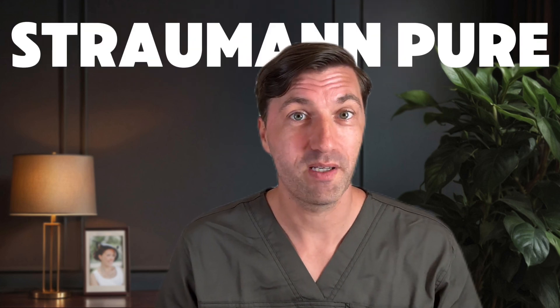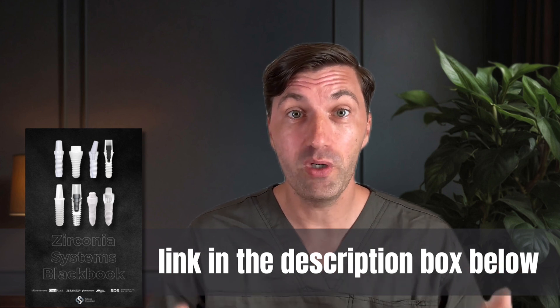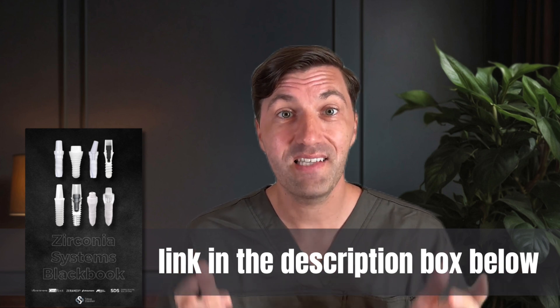I've pulled together all the crucial facts about the Straumann Pure Ceramic System, so stick around till the end because I'm giving away my Zirconia Systems Blackbook for free. It's packed with essential insights and data on all the major ceramic implant systems out there.